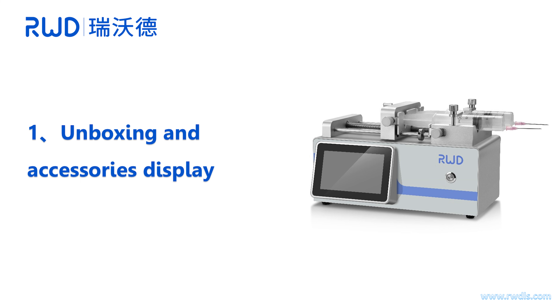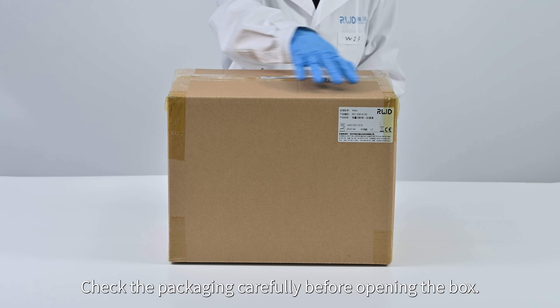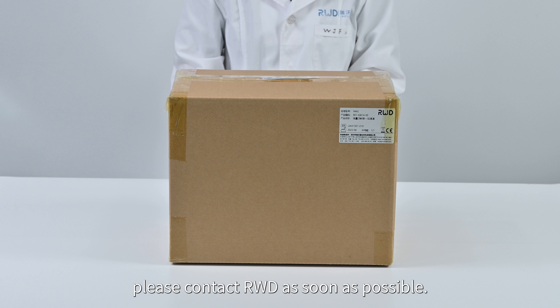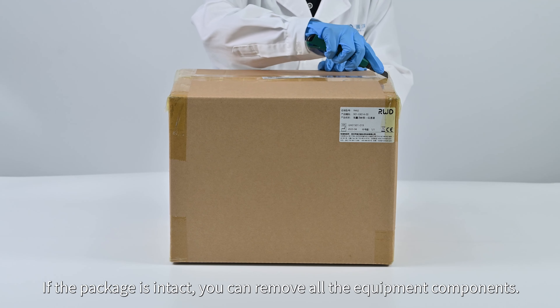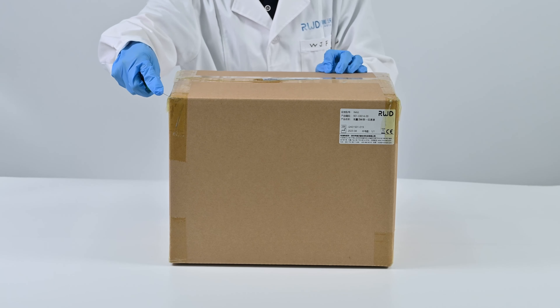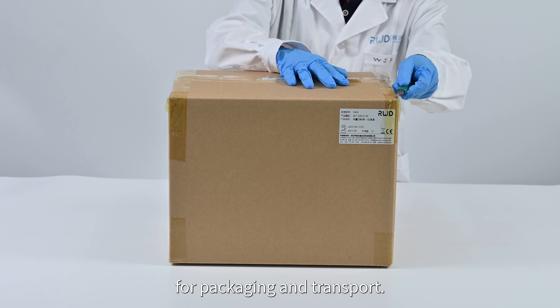Unboxing and accessories display. Check the packing carefully before opening the box. If you find any broken seals, crushed box, etc., please contact the vendor as soon as possible. If the package is intact, you can remove all the equipment components. Please save the box with packing materials for future packing and transport.